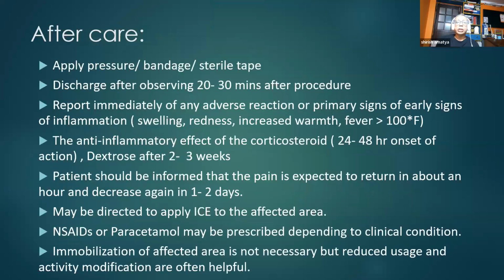corticosteroid. After injection of steroid as well as dextrose, there are a few things we should take care of, especially the aftercare. After the injection, we should apply a pressure bandage or even sterile tape. Usually the patient is discharged 20 to 30 minutes after the procedure, after observation, because sometimes an anaphylactic reaction or delayed anaphylactic reaction can occur, or the patient can be dizzy following injection of lignocaine in a larger volume. So it is always advised to keep the patient under observation for 20 to 30 minutes after the procedure.